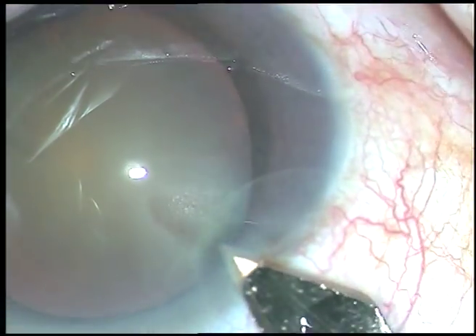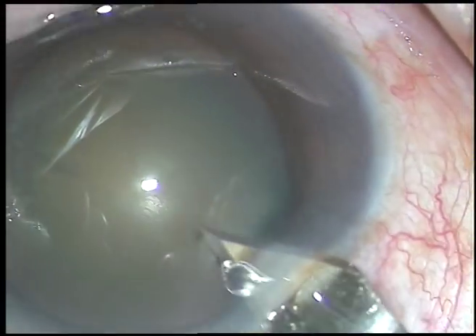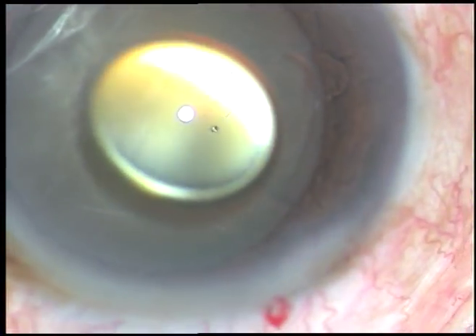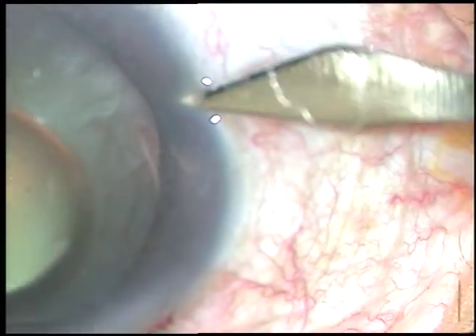Dear colleagues, in this surgery, capsulorexis was small. When the capsulorexis is small, there is a risk of capsular phimosis. So, we should enlarge the rexis just before nucleus management or after implanting the intraocular lens.